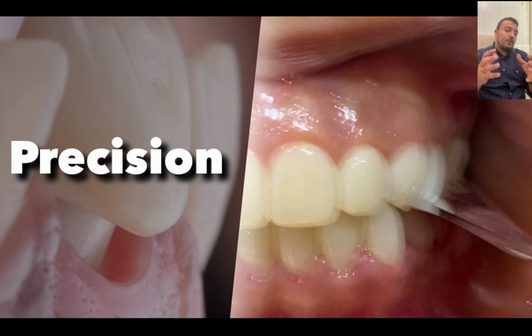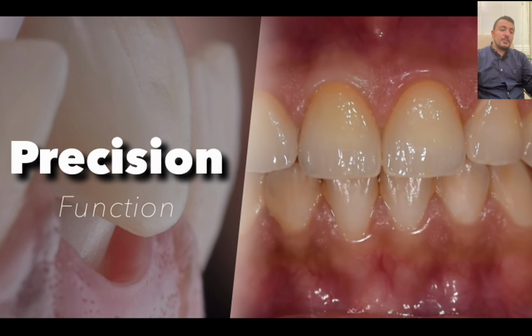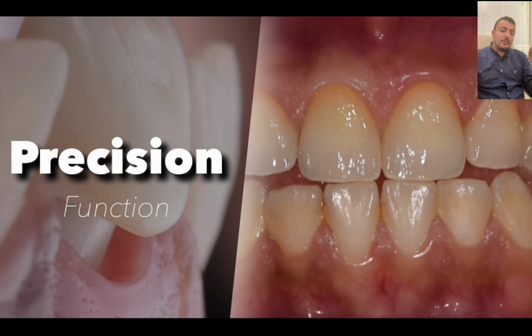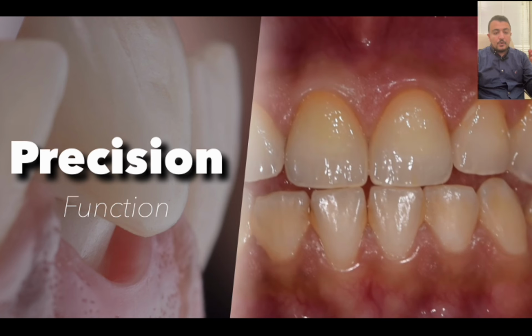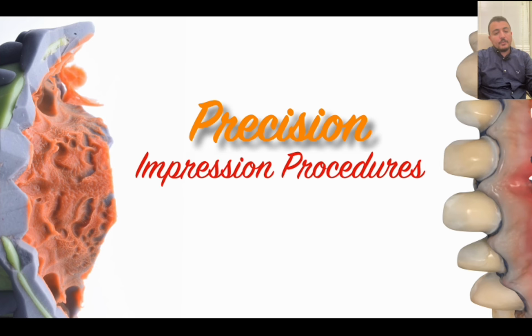So usually our role as a prosthodontist is to restore with precision, to restore the ideal occlusion, and also to restore and duplicate the patient's functional movement to a very good level without any interferences or without affecting the patient's border movement or functional movement. And usually this precision is related to the impression making techniques, either doing the impression with a digital protocol or with your conventional protocol.